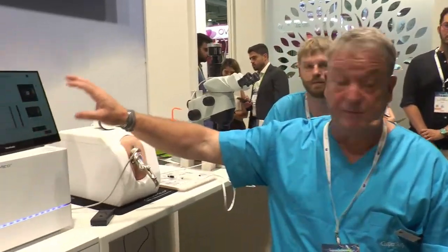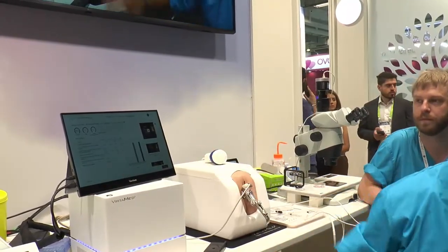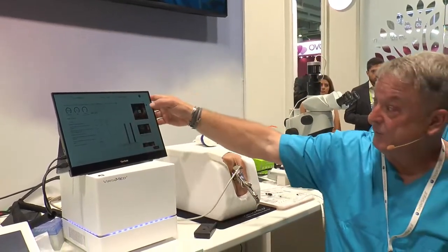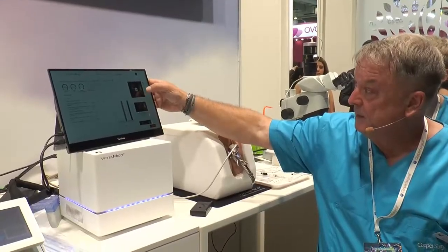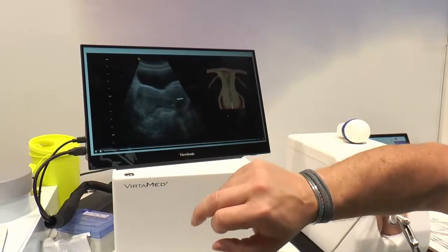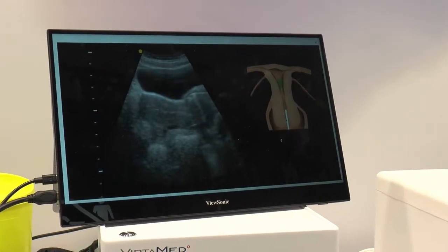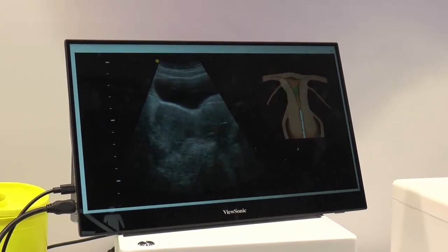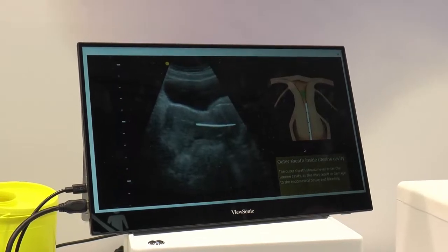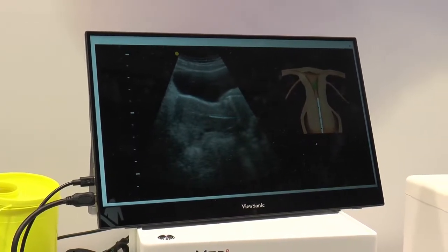The system is set up, so when I log in, it records everything that I do. So it's recorded this one. When I do it another time, it will record. It gives me all that data. It also gives me the opportunity to look back and record what I did and how I did it. So I can play back. On a simple transfer, it's not so important. But where the cervix is convoluted or you've got a false passage, something like that, I can use the recording to see what I did and see where eventually when I got in, how I did it.